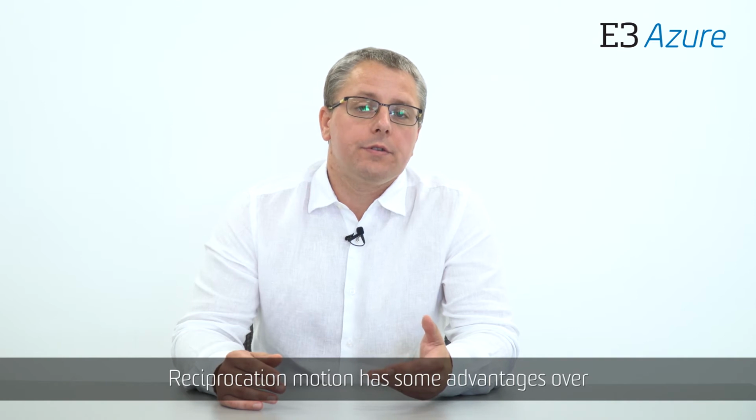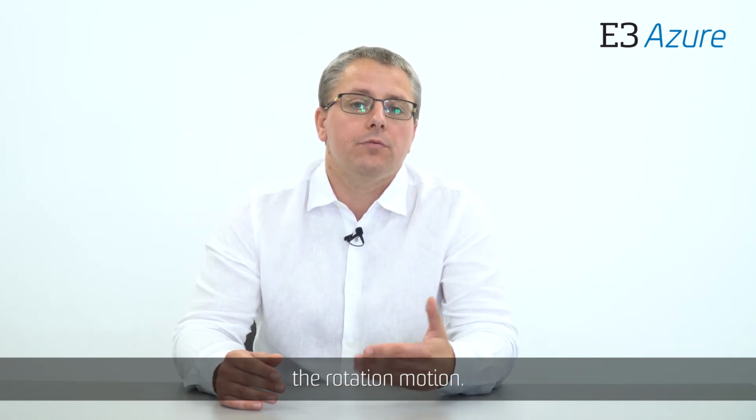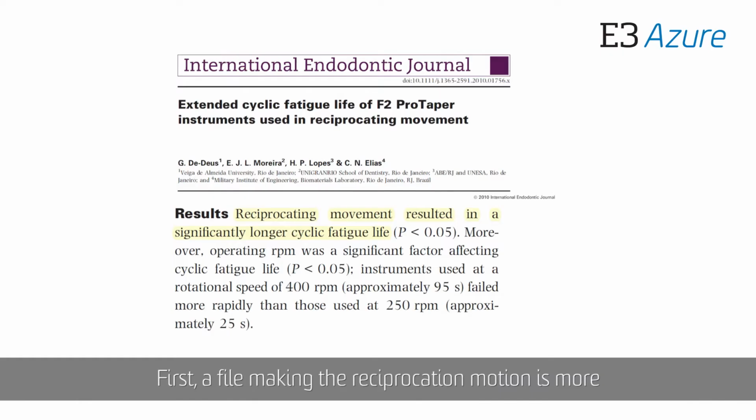Reciprocation motion has some advantages over the rotation motion. First, a file making the reciprocation motion is more resistant to cyclic fatigue, so it can work longer in a curved canal before it breaks.